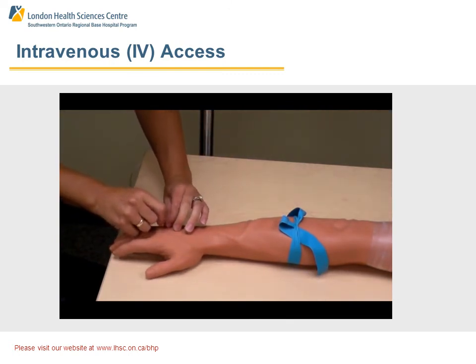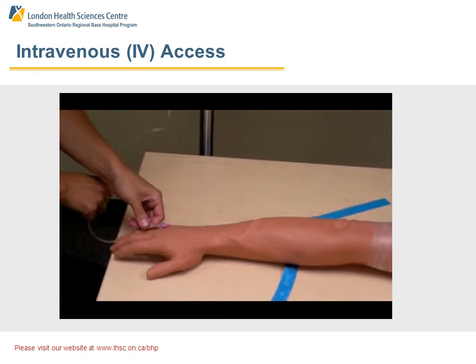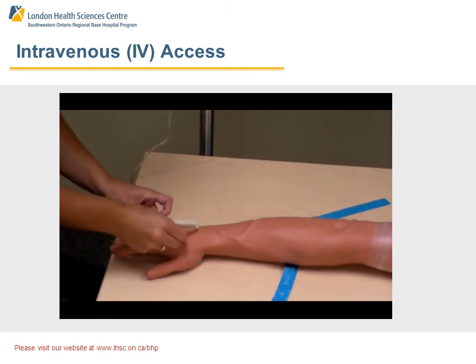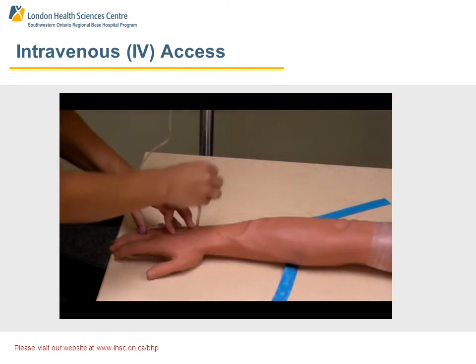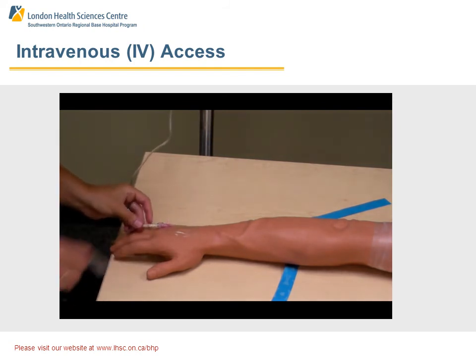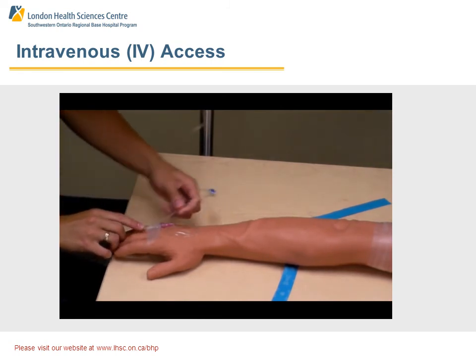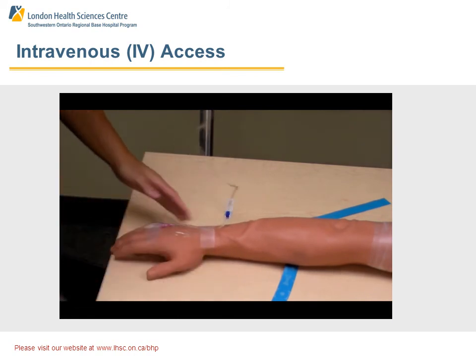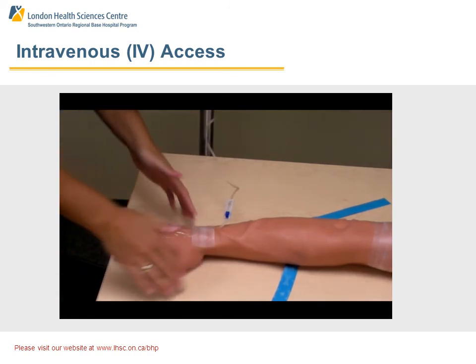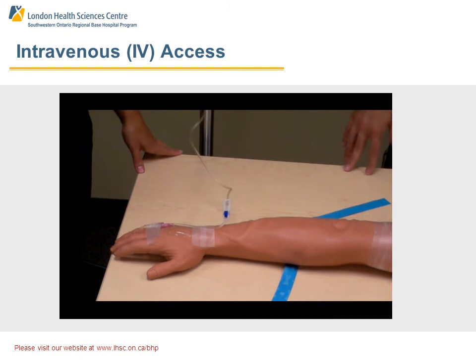Attach the IV tubing and then release the tourniquet. Open up the line and make sure that there's no swelling. Now attach the tegaderm and secure with tape. If an IV is interstitial, there are a few signs you can look for right away. The most obvious one is you won't get good drip out of the bag because of the increased resistance in the tissues versus the vein. You'll often see soft tissue swelling around the area of the IV catheter, which indicates that the fluid is going into the soft tissues and not into the vein itself.